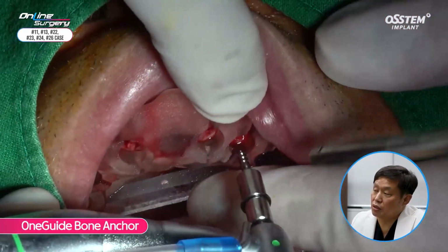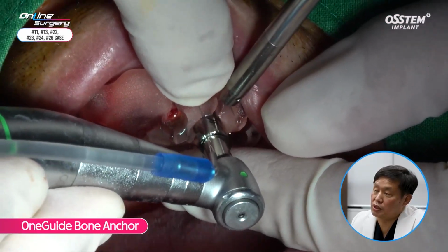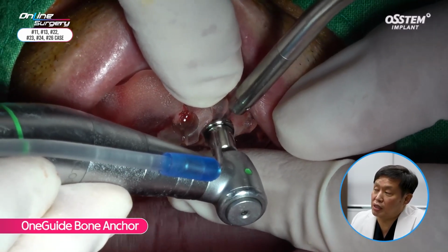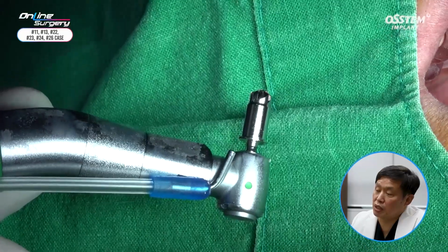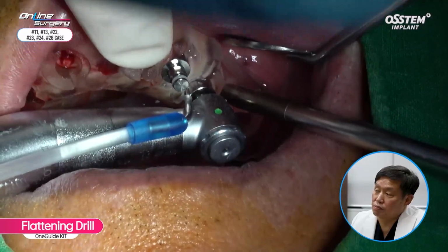Bone anchors were used. In number 23, the patient's left side is all distal free end, so sure fixation is necessary. This is essential in preventing any deviations in the anterior zone. Moving on to number 24, flattening drill was used first.